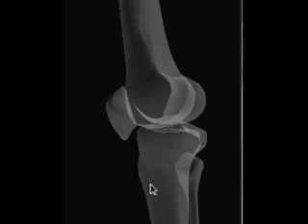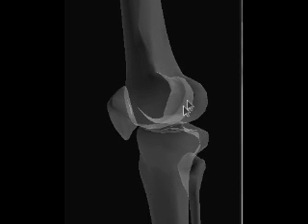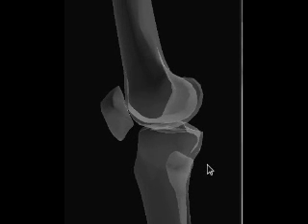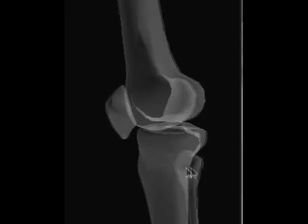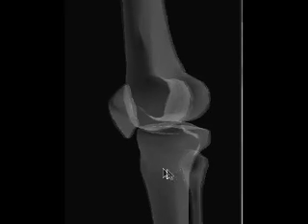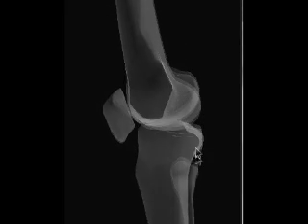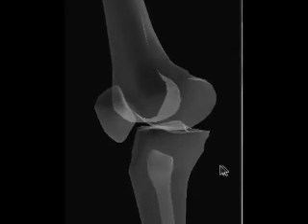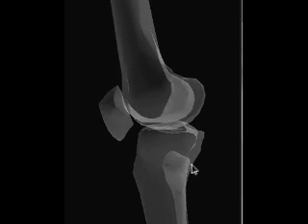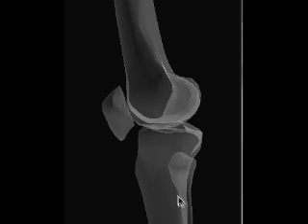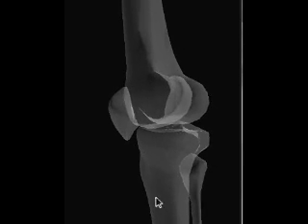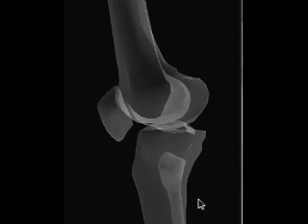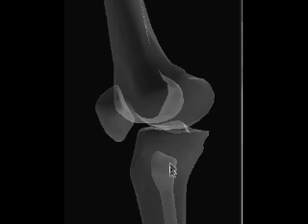If we were to put this right where it should be, you can see we're pretty over-rotated there. But at least we can get a pretty good, solid idea of the perceived motion of the fibula when we rotate the knee or angle the tube a little bit. As we externally rotate the knee, you can see the proximal fibula — the fibular head — appears to move backwards. And as we then internally rotate the knee, you can see that the fibular head becomes very, very superimposed over the tibia.